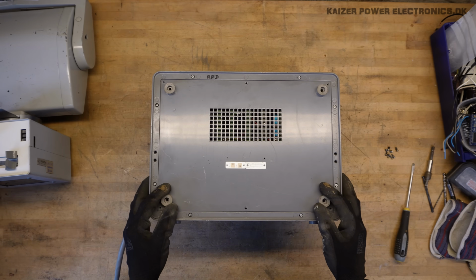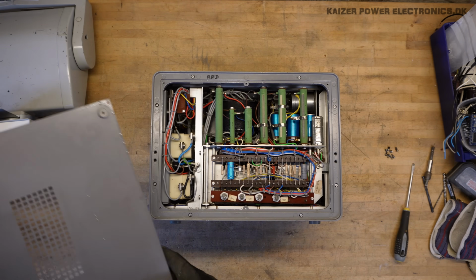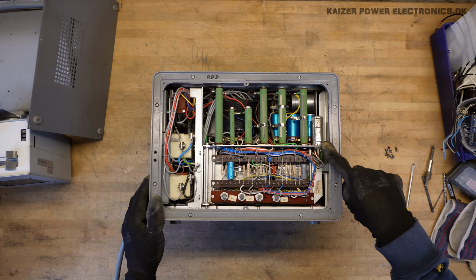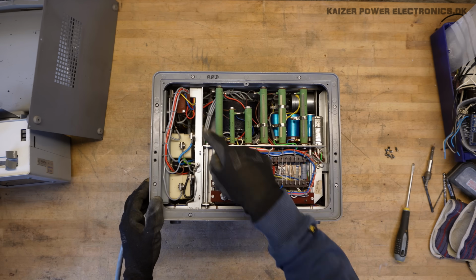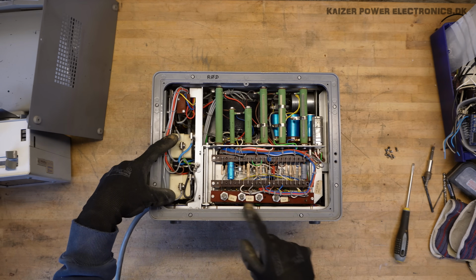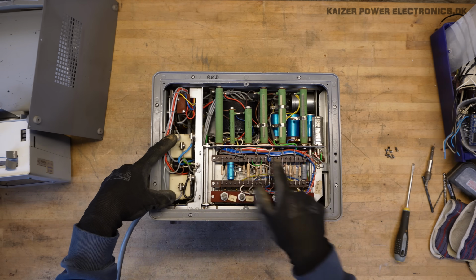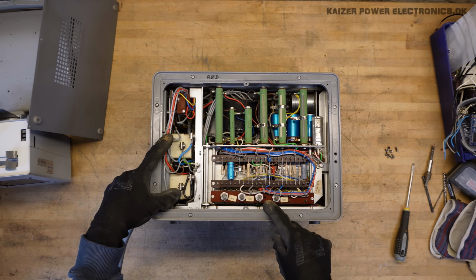The back plate was just fastened by 6 screws, so let's see. Oh nice, what do we have here? We actually do have some vacuum tubes. Adjustable power resistors, some huge transformer, we have our fuse elements. And down here we seem to have potentiometers, so most likely for calibration. We have all our component strips sitting here. Some early diodes, very nice stuff here.